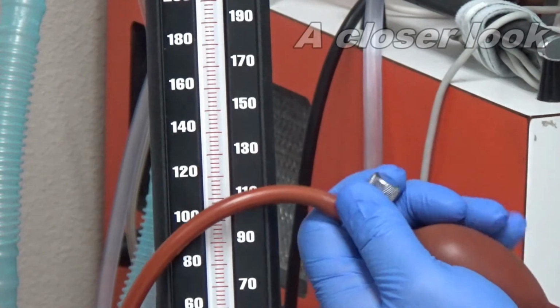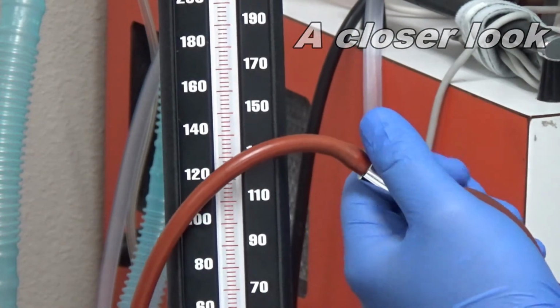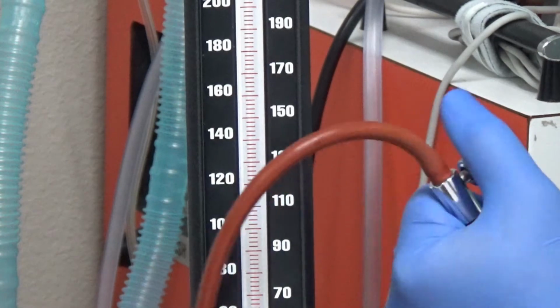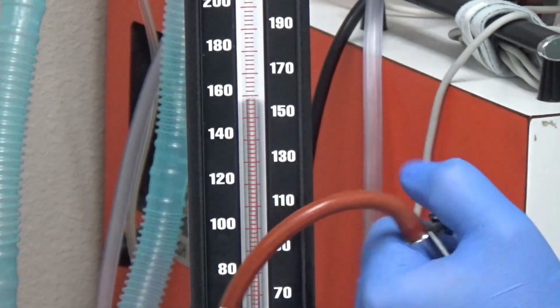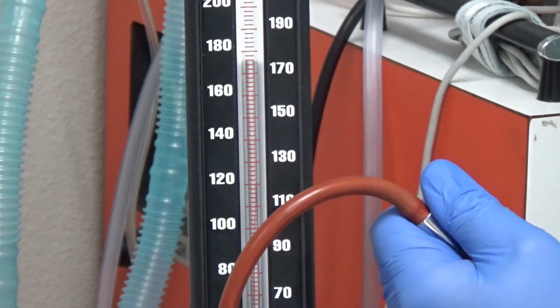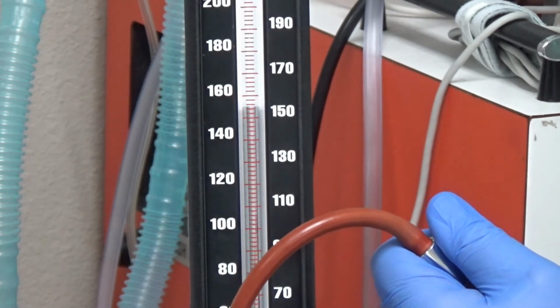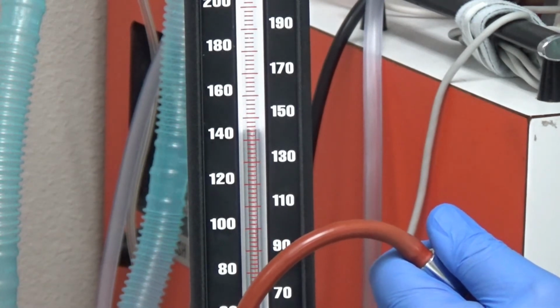So we're going to make sure that this cuff is closed. Again, clockwise is closed, counterclockwise is open. If it's closed, we're going to pump up the balloon to about 180, 160 to 180, okay? Then we're going to slowly release it, probably like 2 or 3 millimeters of mercury per second. And you can see it pumping up and down there.